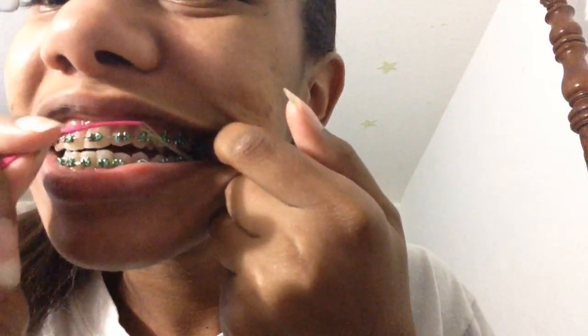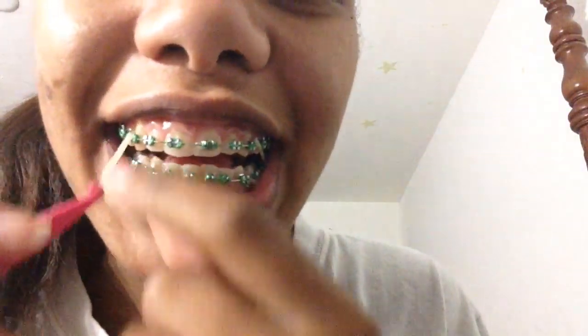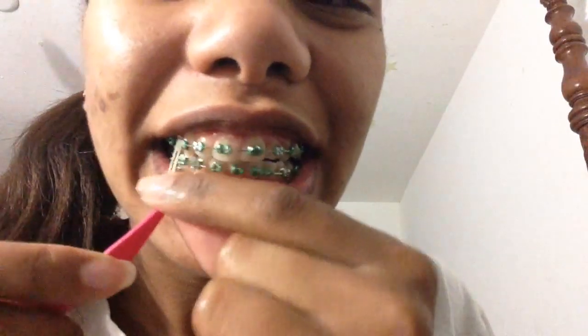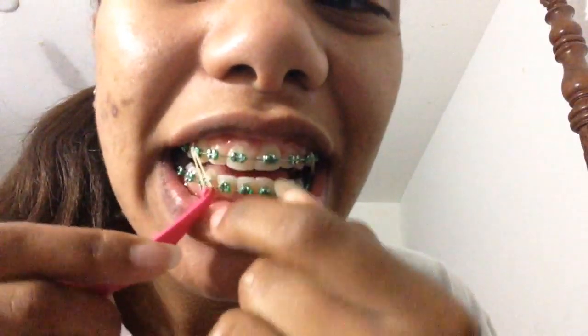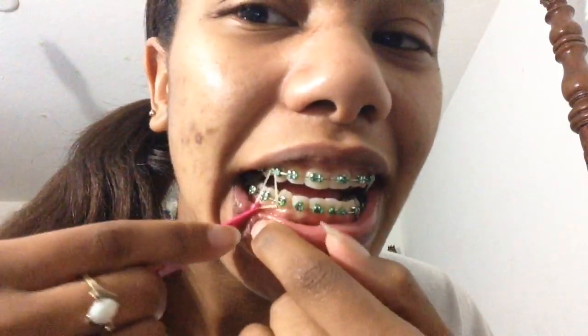My last one — this one is a triangle from my canine to the bottom here, just like this. Since they're fresh they hurt, but my teeth will get used to it.